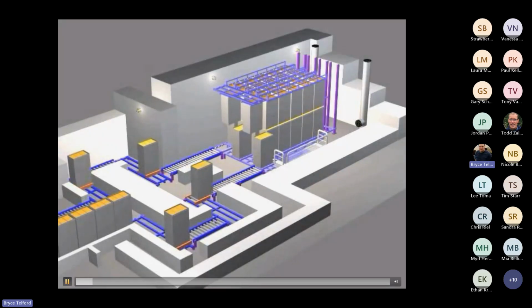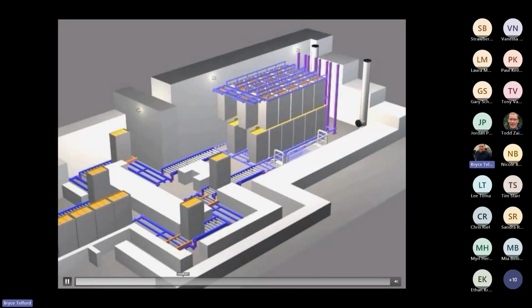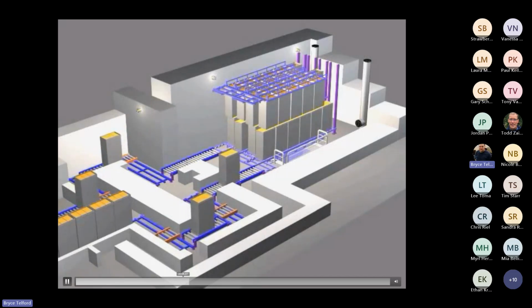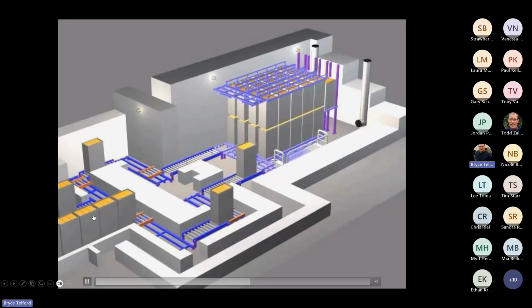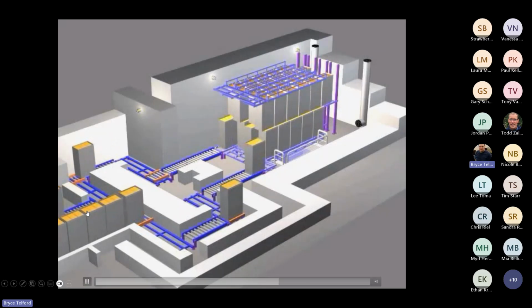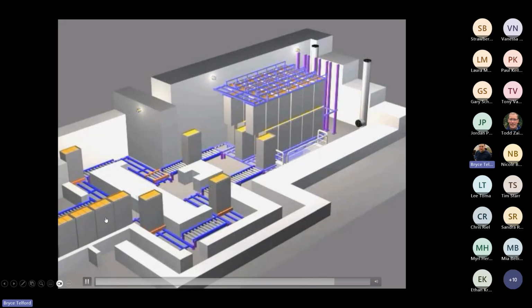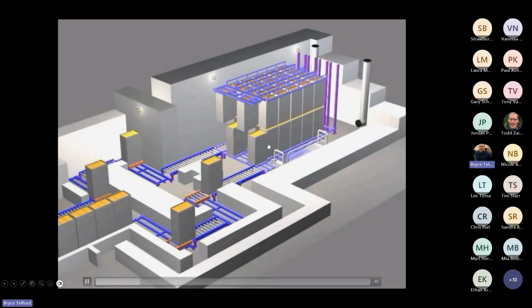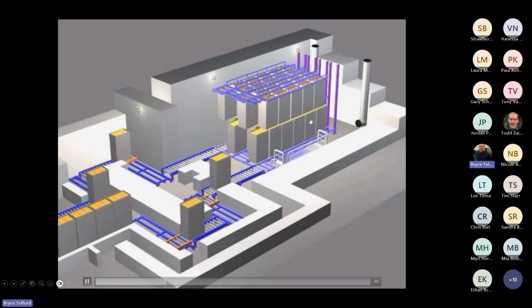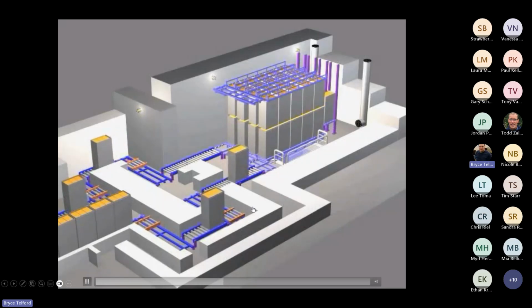So for gamma sterilization, we have what is known as shuffle and dwell. Product is going to be loaded onto carriers. So we have our boxes of individual product, for example, kind of illustrated, and that is being loaded into a set carrier. That carrier is then going to be loaded into this pathway into the gamma irradiator, and it's going to go into various positions, and it's going to dwell there.